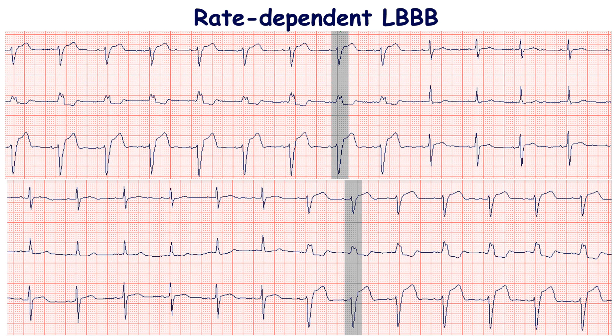At this ECG we can see left bundle branch block occurring at a heart rate of 68 beats per minute and more. This is the critical heart rate. If heart rate is higher than this value, the left bundle branch block is obligatory. At heart rate less than 68 beats per minute, there is normal conduction in the ventricles.